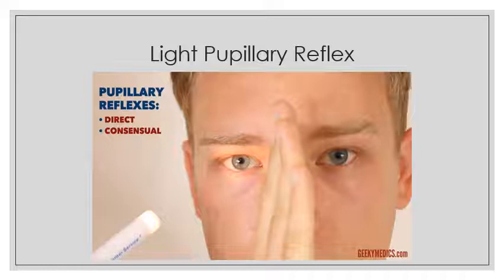At least ask to minimize the room light to the minimum permitted amount. You should separate between both eyes using the patient hands as we see in this slide.